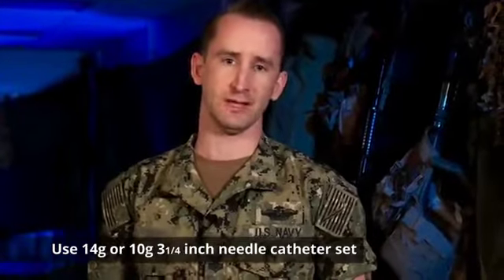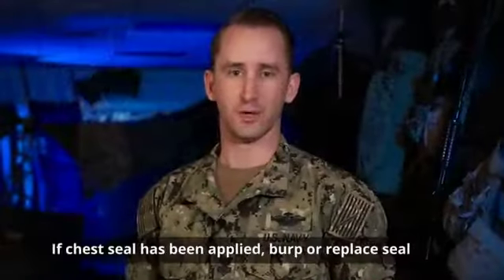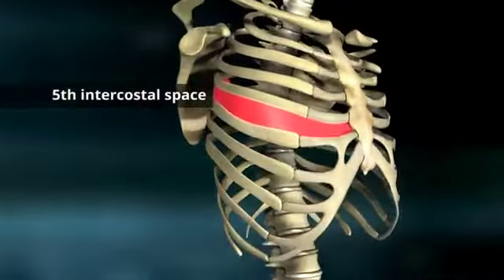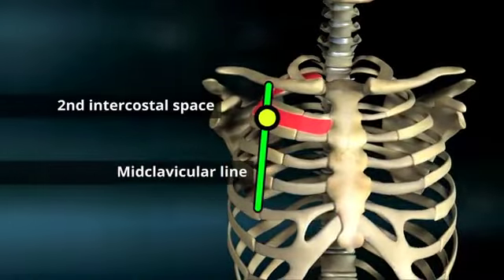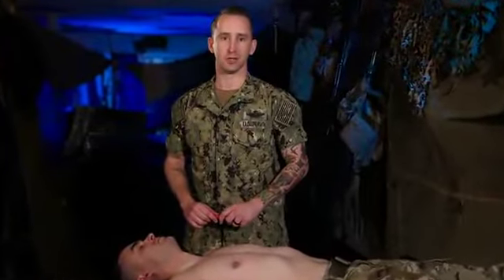The needle chest decompression is performed using a 14 or 10 gauge 3 1/4 inch needle catheter. There are two acceptable sites for the needle chest decompression: the 5th intercostal space on the anterior axillary line or the 2nd intercostal space at the midclavicular line. I'm going to demonstrate on the 2nd intercostal space, midclavicular line.